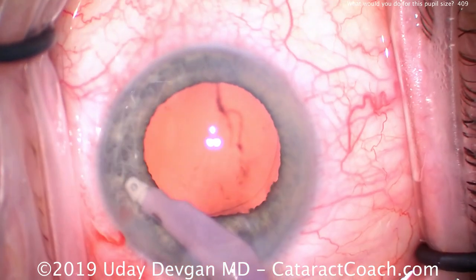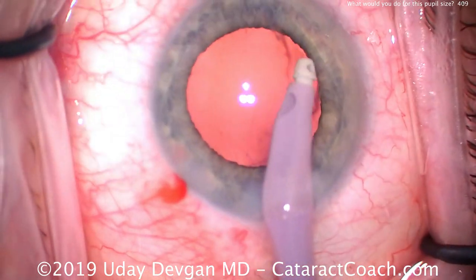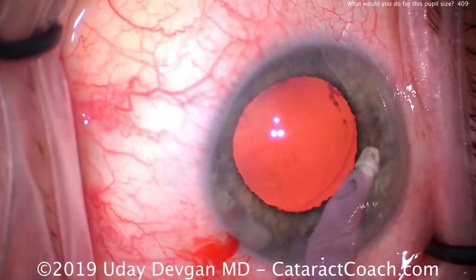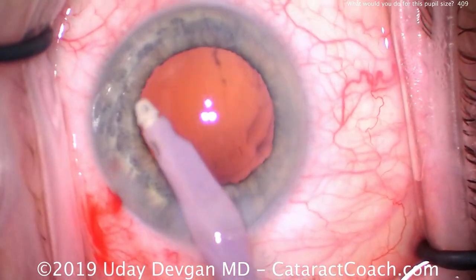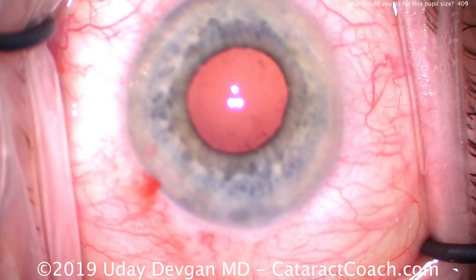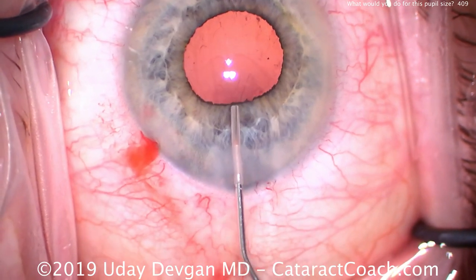We're cleaning out the anterior chamber, making sure there are no little fragments left, and removing some of that dispersive viscoelastic. As we come out of the eye, you'll notice the pupil is going to become smaller again — there it is. Without the infusion pressure holding it, it becomes smaller. So we'll refill the capsule bag now with a cohesive viscoelastic.